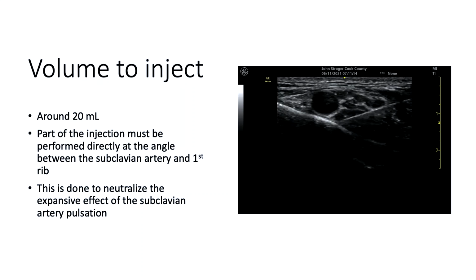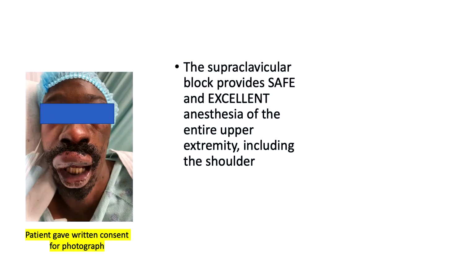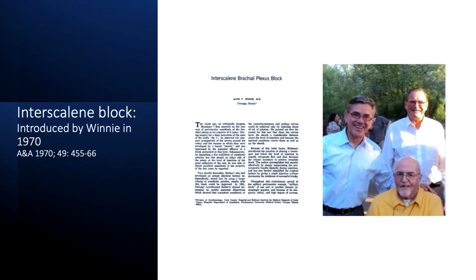That is the success of the supraclavicular block. Now you know that you can sign that chart and go for your coffee, because that block is going to work. That block is going to work. So, it is just as simple as that. And then you can do it in all sorts of patients. This patient, you can see how swollen his lips are. He has been beaten, and you know, he got a wonderful supraclavicular block for whatever other problem he had.